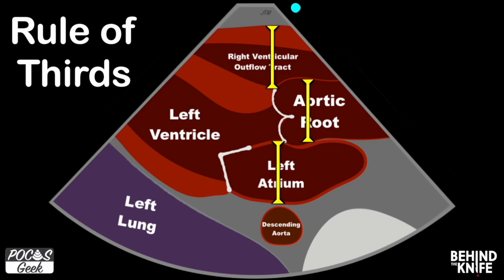Now, keep in mind a left atria that is enlarged might be mild mitral insufficiency, or it may be horrible mitral insufficiency. And so we've got to take it with a grain of salt. We've got to watch everything else going on in the ultrasound, but this will help us at least know, is a chamber big? Now, I would caution you, if the right ventricle is ever big, I'm not as worried about fluid responsiveness as I am figuring out why that is and how to fix that.